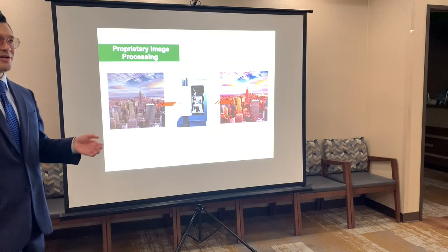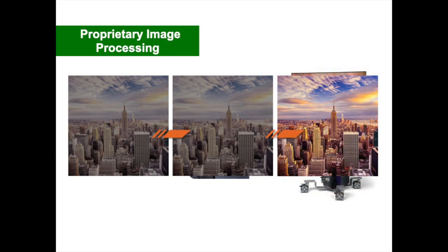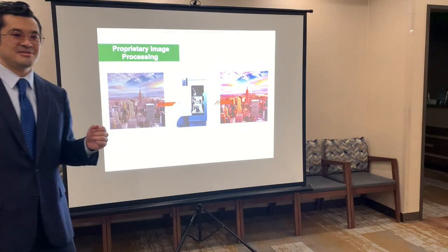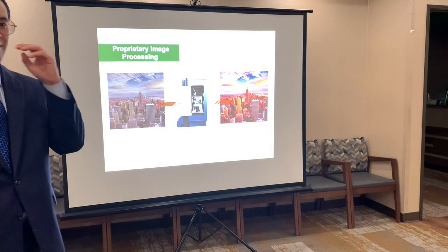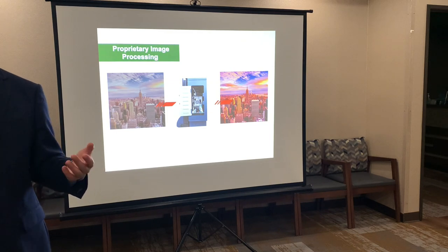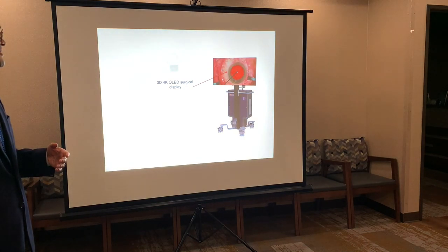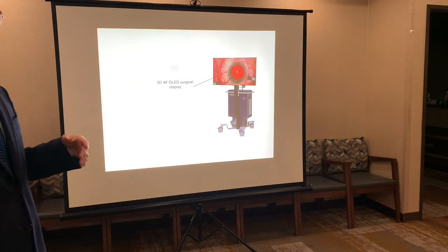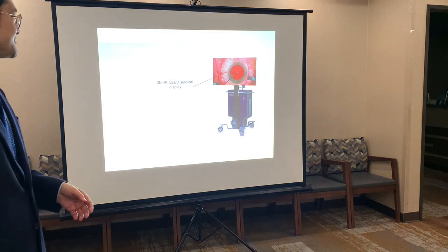Interesting, especially now as AI systems are coming into place. You can take an image and process the image to give you more contrast, or process the image to have overlays of maybe how big to make your capsulorhexis or where the steepest point of astigmatism is. So there's so much that is going to happen when this technology becomes more available here.